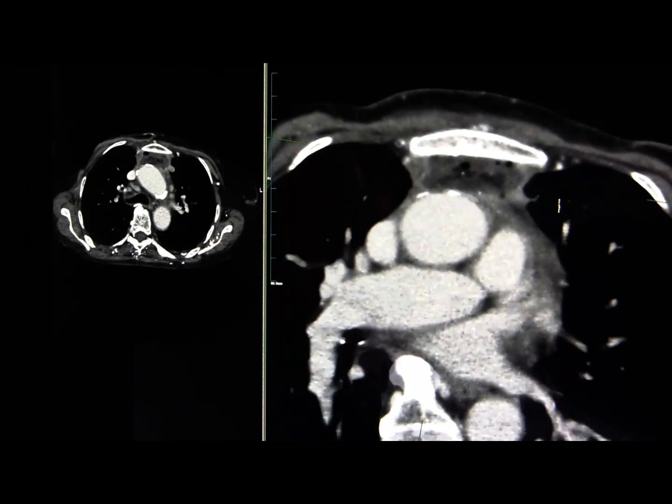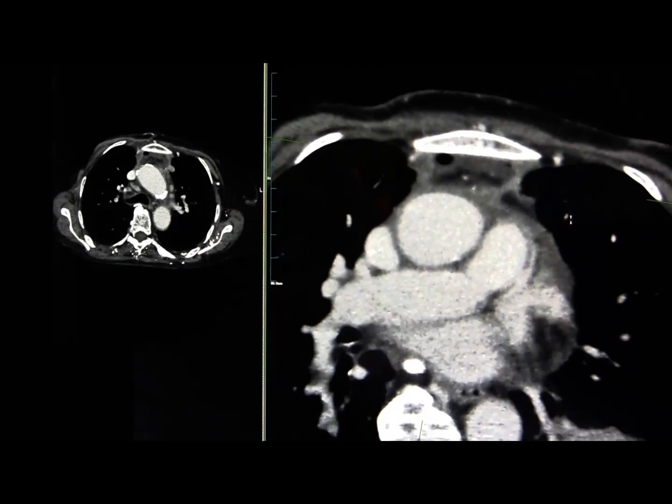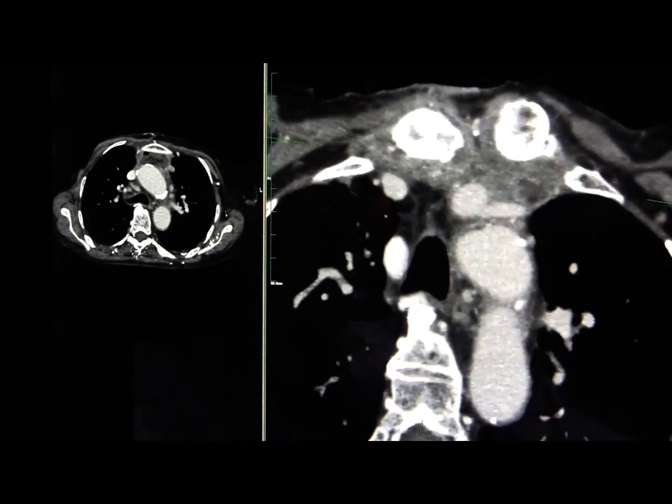Obviously the issues here are that we will then have our little drain immediately in front of the ascending aorta, so we've got to be careful about that. I'll endeavour to keep the drain down here with a tiny amount of padding between the aorta and the inferior extent of the abscess. We're looking for dependent drainage. We don't want to be up the top here.